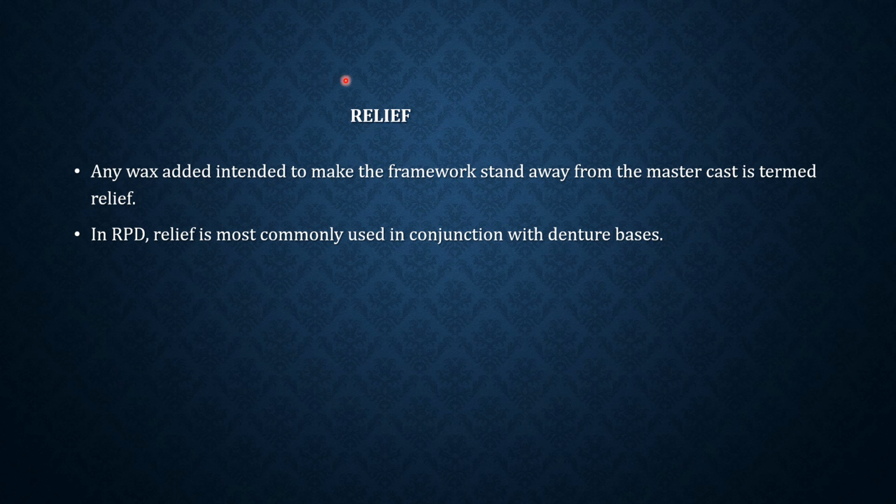Coming to relief: any wax added that is intended to make the framework stand away from the master cast is termed relief. So yes, we do relief.